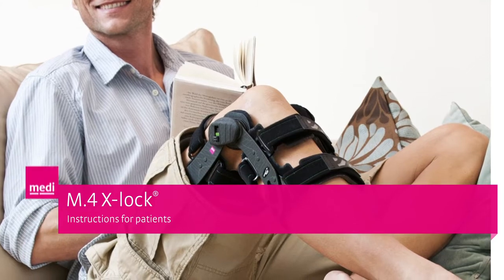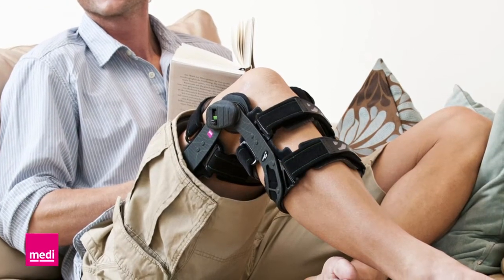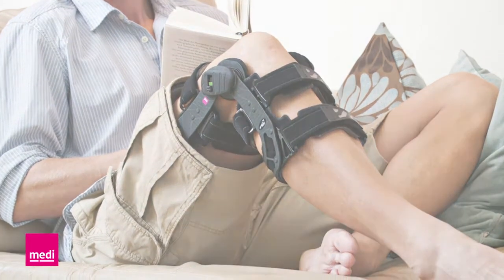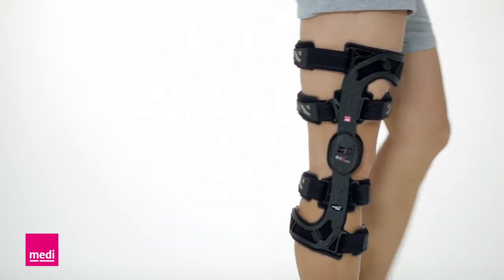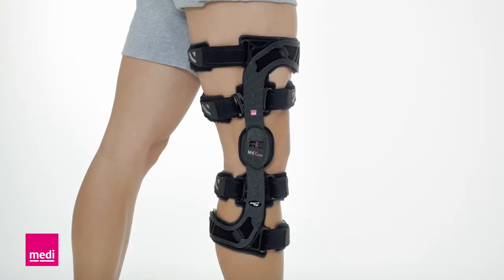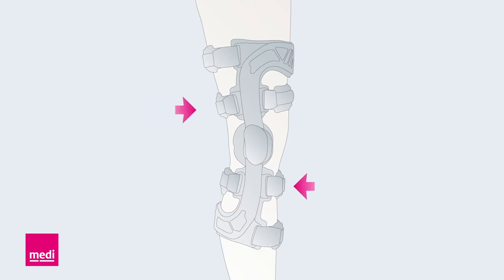The following film will give you helpful hints on patient care with the Medi M4 X-Lock knee brace. The M4 X-Lock is mainly used for indications that permit axial loading in full extension during post-operative aftercare, for example, meniscus refixation. The sophisticated frame system ensures optimum stabilization of the knee joint based on the 4-point principle.